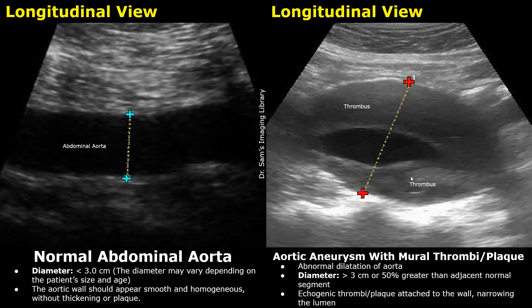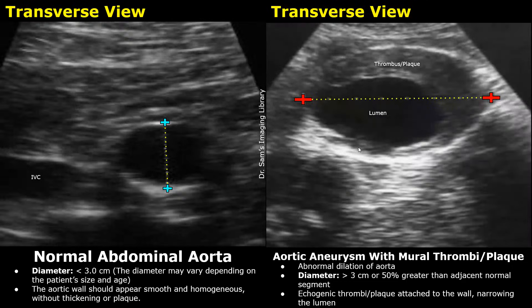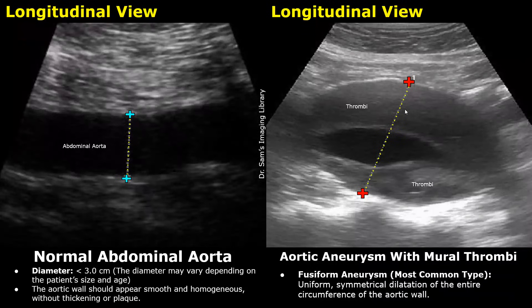The lumen is very narrow in this case. This anechoic area is the lumen. Here is an image in transverse view showing an aneurysm with a thrombus or plaque narrowing the aortic lumen. A plaque and a thrombus can appear similar on ultrasound. Most aneurysms are fusiform aneurysms — there is a symmetrical dilatation of the entire circumference of the aorta. It is the most common type.